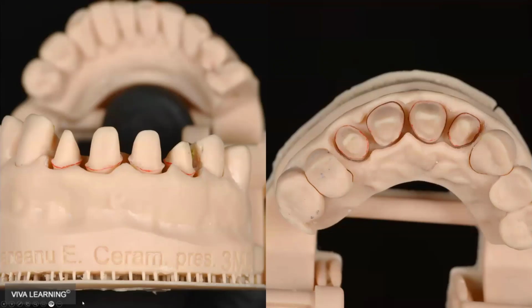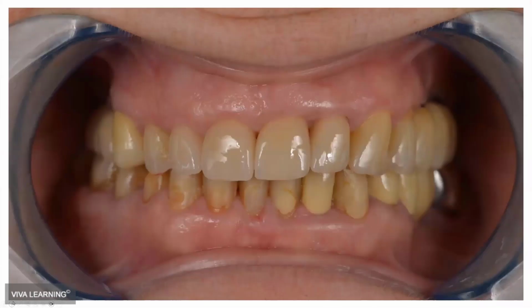You can see now the printed models with removable dies, and the final restoration is in place with the margins just a little bit subgingival.